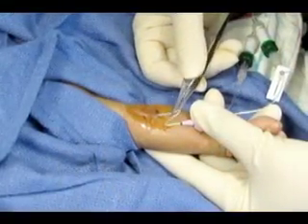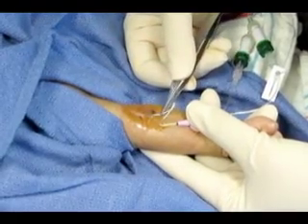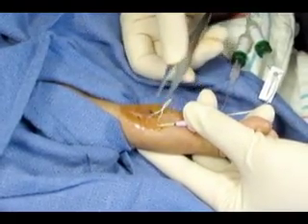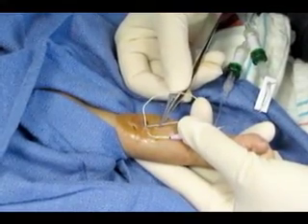When the removal of a neonatal PICC is difficult, redressing of the catheter and another attempt at removal after a period of several hours, flushing of the catheter, or surgical consultation may be required.